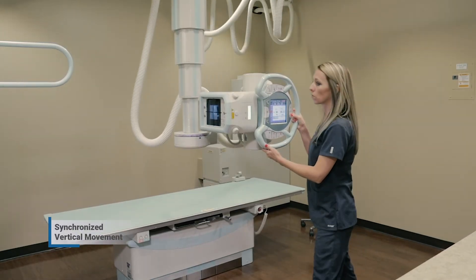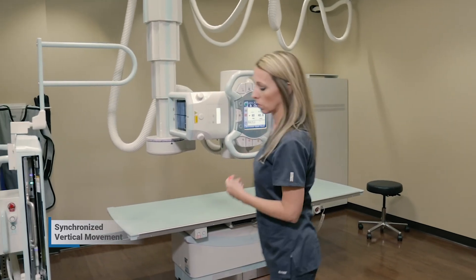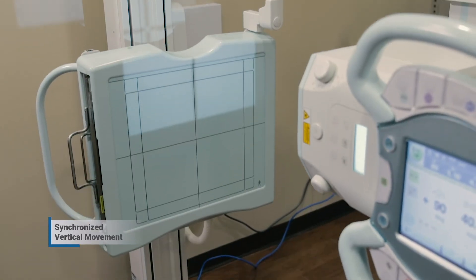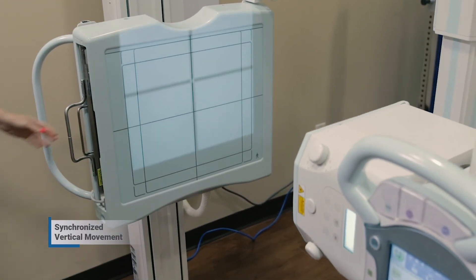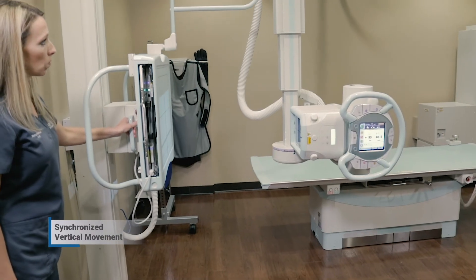System operation becomes even easier with the synchronized vertical movement of the overhead x-ray tube and the wall bucky. With the touch of one button, technologists can synchronize the auto-tracking feature, allowing the technologist to stand close to the patient, ensuring patient safety.